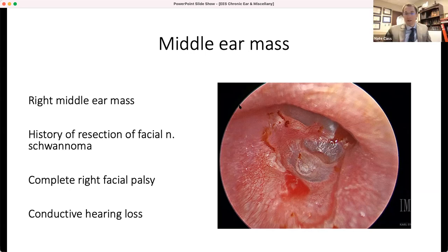Yeah, I think this is a tricky thing to do when you're starting out. It doesn't come easy, and you have to be very, very detail oriented, especially on the anterior surface. This maneuver probably takes me longer than any other exposure maneuver in a tympanoplasty, because I fear causing an iatrogenic intratympanic membrane cholesteatoma.